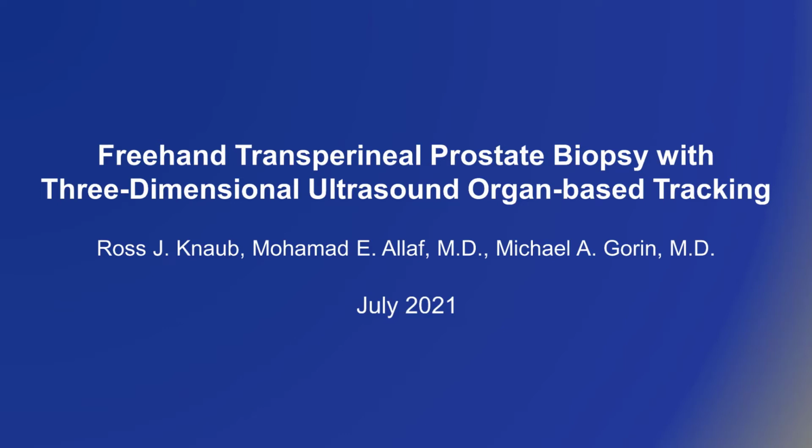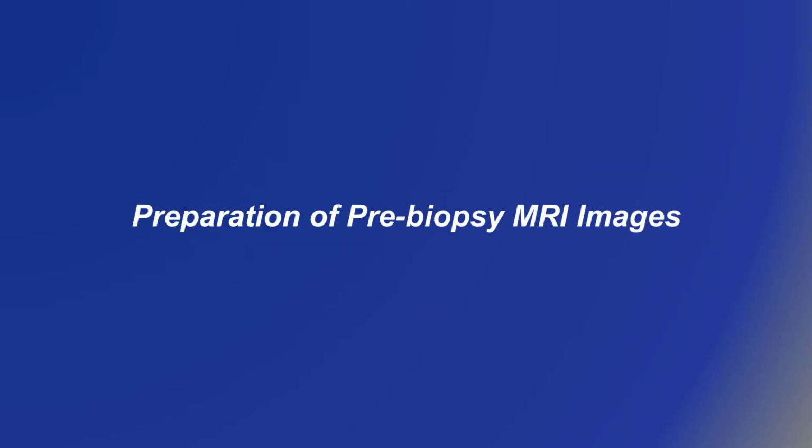Freehand Transperineal Prostate Biopsy with three-dimensional ultrasound organ-based tracking. Preparation of pre-biopsy MRI images.